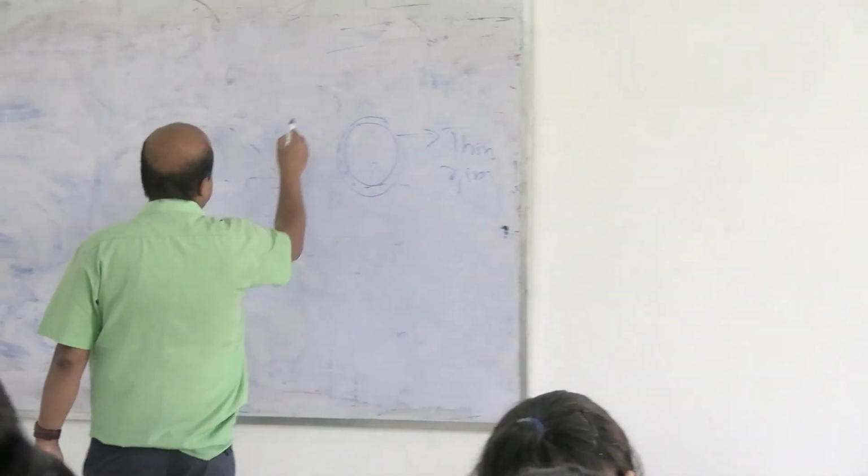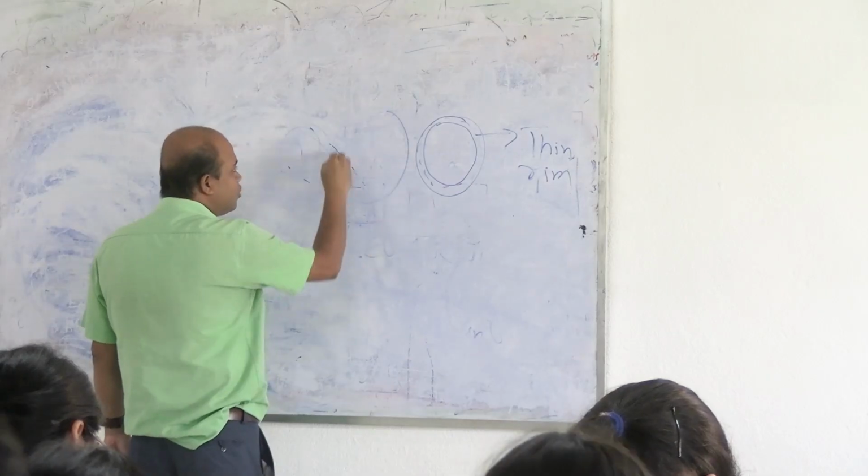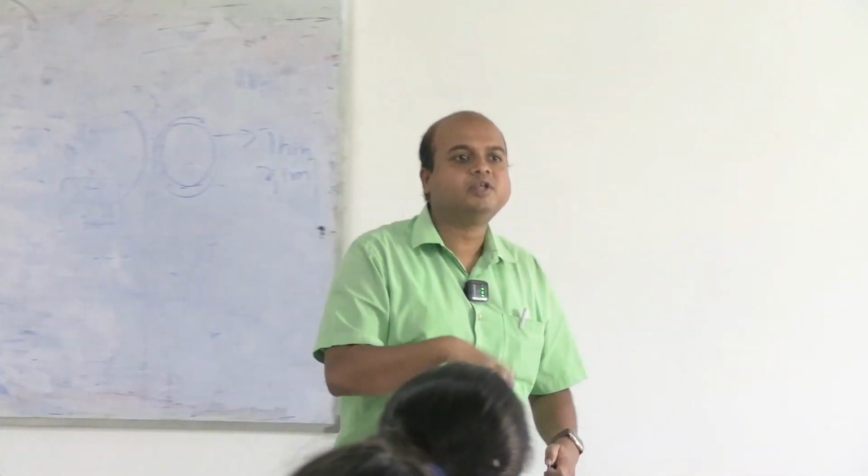Now some lymphocytes, just by looking at the size, you may comment as large lymphocytes or small lymphocytes. Small lymphocytes are more or less the size of the RBCs, maybe a little larger, but large lymphocytes are much larger. If you compare with the surrounding RBCs, it is easy to comment whether it is a large one or a small one. And monocytes are larger than the large lymphocytes also. Now again you will compare it with the RBCs, or if you have found some neutrophils already, one or two neutrophils, one or two eosinophils, okay, few neutrophils.